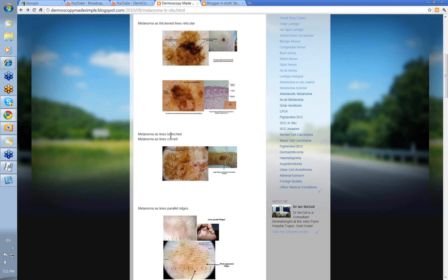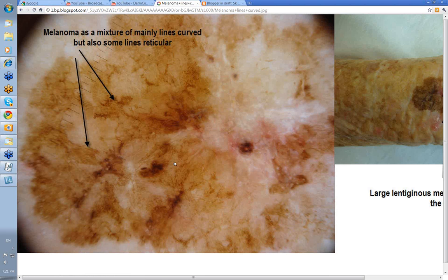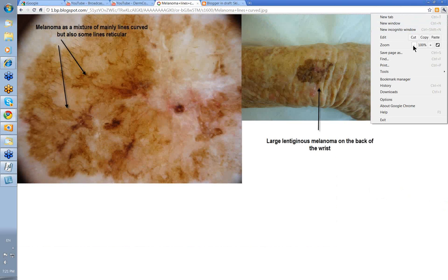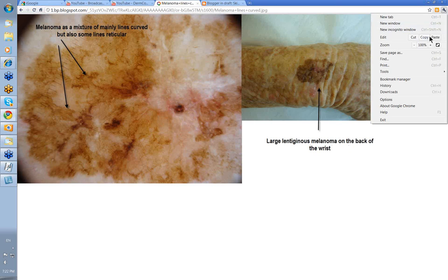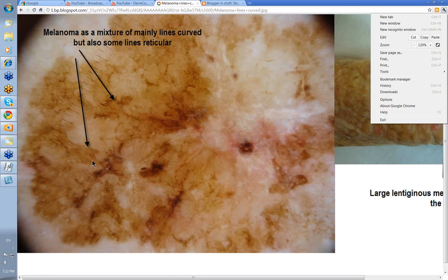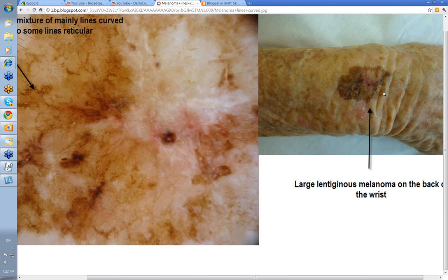I haven't got melanoma as lines branched — usually it's lines branched peripheral and it's usually seen in association with lines reticular. What about melanoma as lines curved? Normally lines curved we see as being a solar lentigo or perhaps an early flat seborrheic keratosis. But this was a large lentiginous melanoma in the back of the wrist, and a lot of these lines here were in fact lines curved, with a mixture of lines and even some small polygons within this. If you dared to biopsy a little bit of it, you might well have got a report of a solar lentigo instead of lentiginous melanoma. Clinically, a solar lentigo wouldn't look like this with the varying types of colors of pigmentation within this.